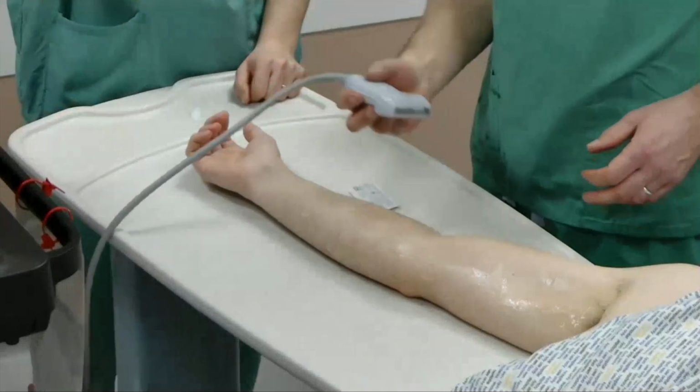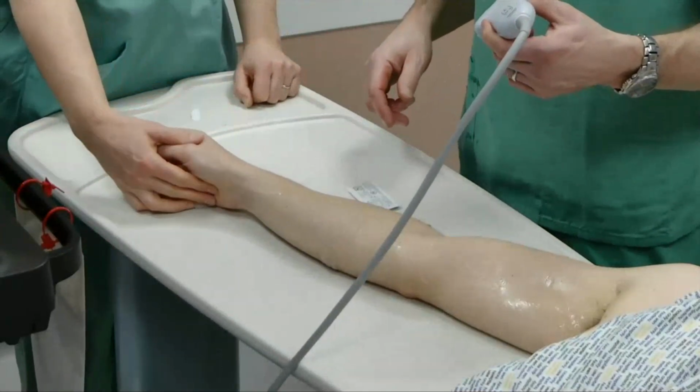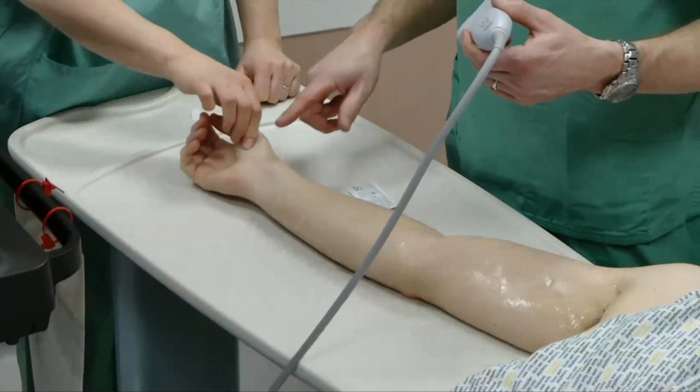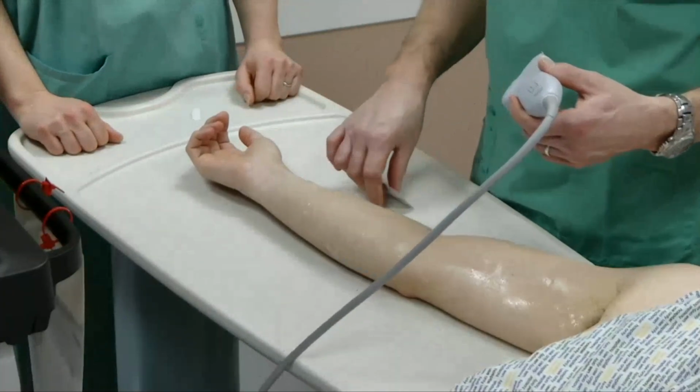Something I found, when the patient's arm starts getting numb, is the hand starts going across, so just watch out sometimes. Some people tape it across the arm, or just get someone to hold it.